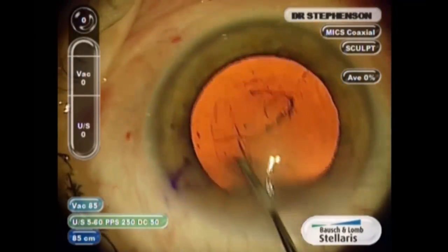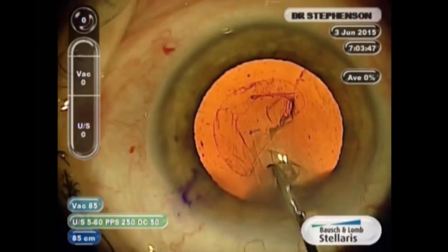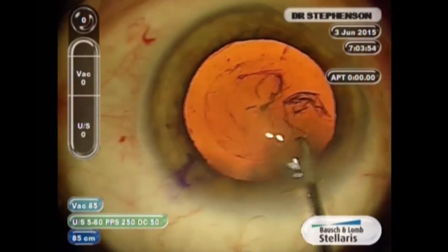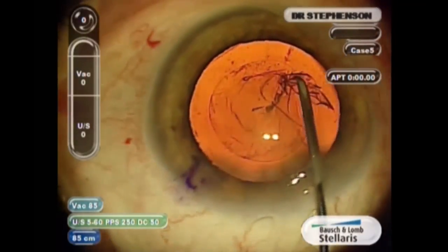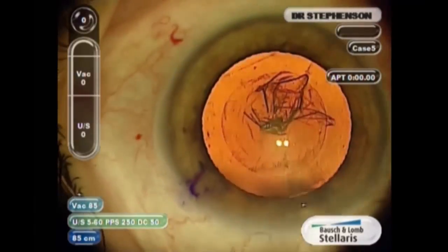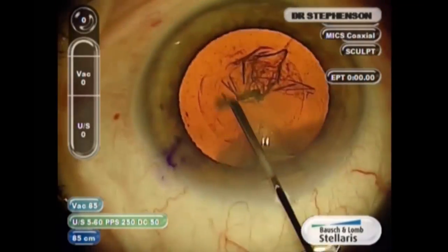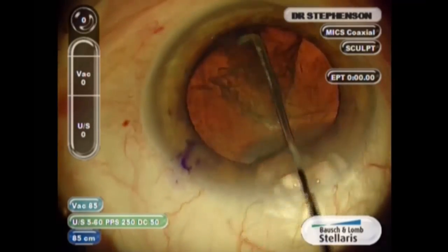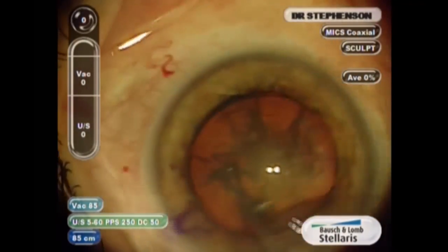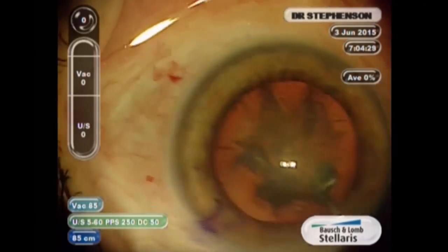I'm going to speed this up just a little bit so we can get to the implants. I'm showing you in fast motion here just the capsulotomy, the hydrodissection, and hydrodelineation that occurs after you've done the capsulotomy. And I do a divide and conquer technique — I still to this day do a divide and conquer technique. I have to give that credit to Dr. Harry Grabo who taught me when I went into private practice 28 years ago.